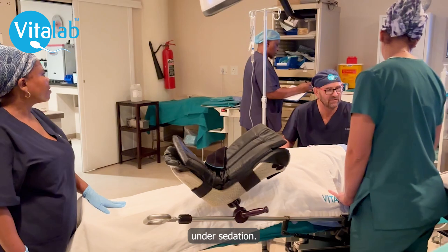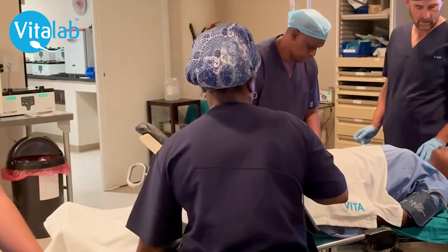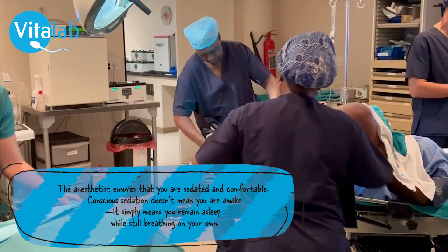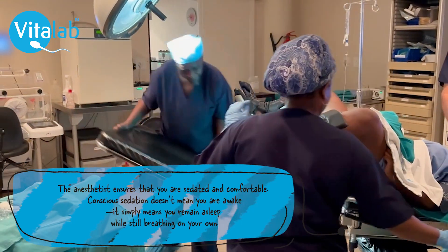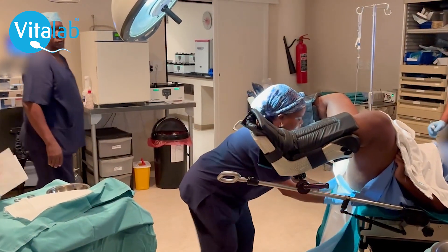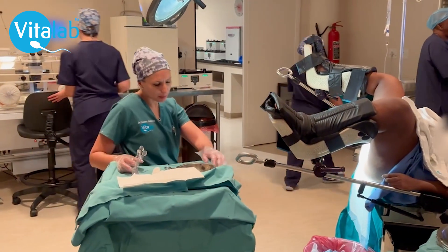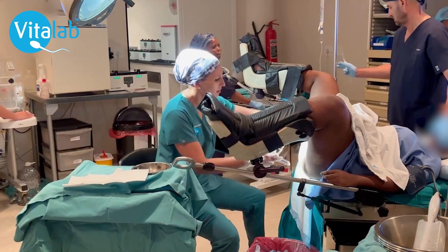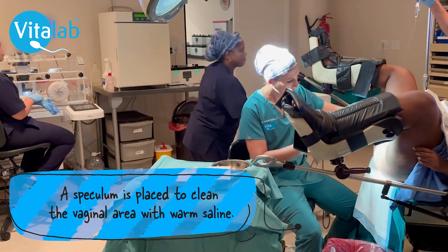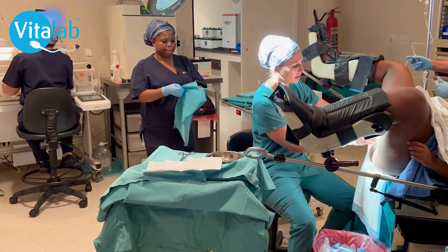The OPU procedure is performed under sedation. So, let's go ahead and get started.